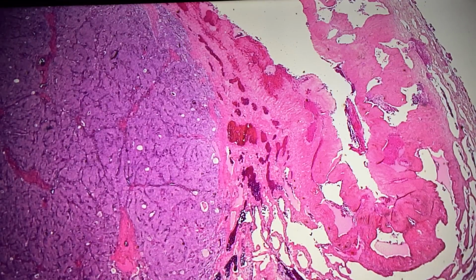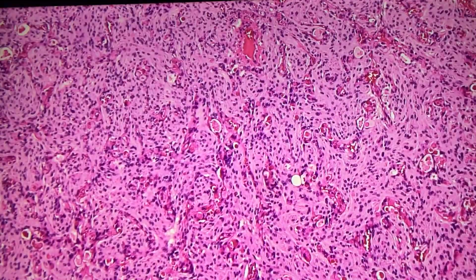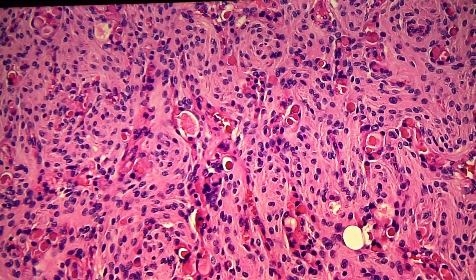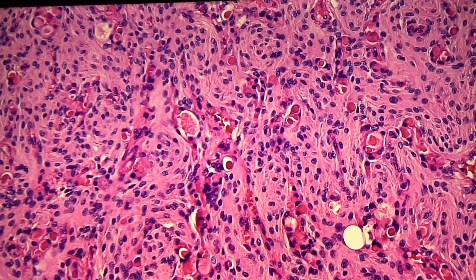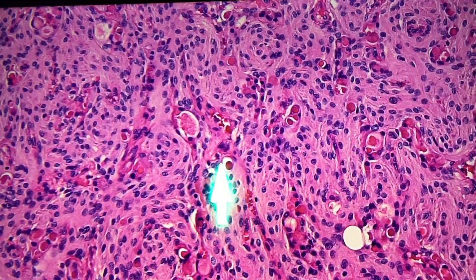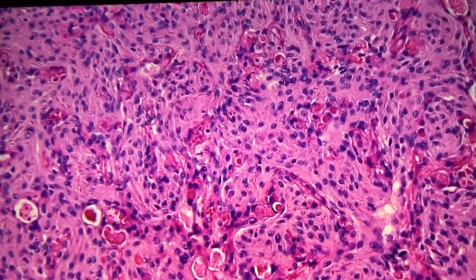Okay, fair. And want to see the cells now? So the dura is right next to it, and the lesion looks like there's a proliferation of spindle cells, and it has eosinophilic cytoplasm, and also it has some kind of inclusion. Do you call it inclusion? Yeah, pretty cool, isn't it? Are they inclusions or whatever they are? They're pretty cool.